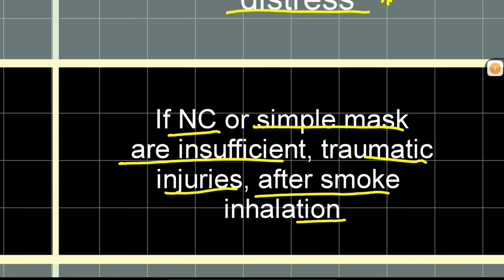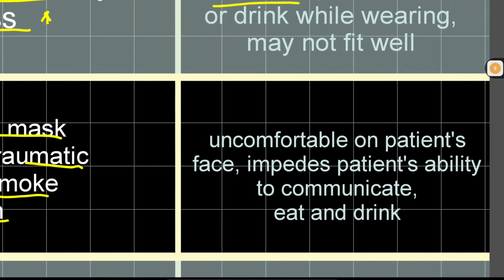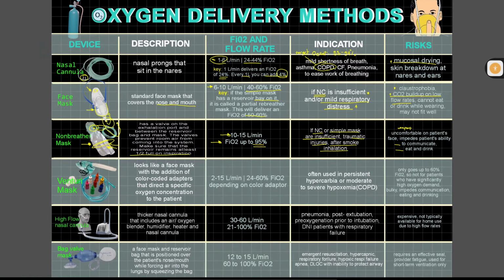So after smoke inhalation, so traumatic injuries after smoke inhalation, so best siyang gamitin. So what are the risks whenever you use a non-rebreather? So of course, yung comfort ng pasyente, mako-compromise. Uncomfortable in patient's face. Impedes patient's ability to communicate, eat, and drink.